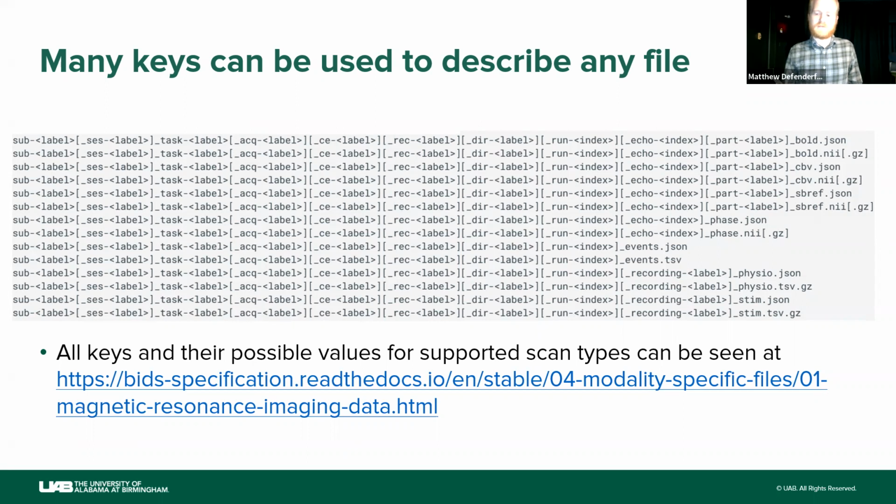Event files. Regarding the TSV event files, could you maybe touch on how one might apply a higher level TSV event file that applies to all participants? Sorry if I missed it. Okay, yeah. So for the event files, every functional scan in a BIDS structure should have an associated events file with it. During the automatic conversion, you're not going to be setting up the events file at that point. You're going to essentially fill it out after the TSV has been created, because it's going to create an empty TSV for every bold file.